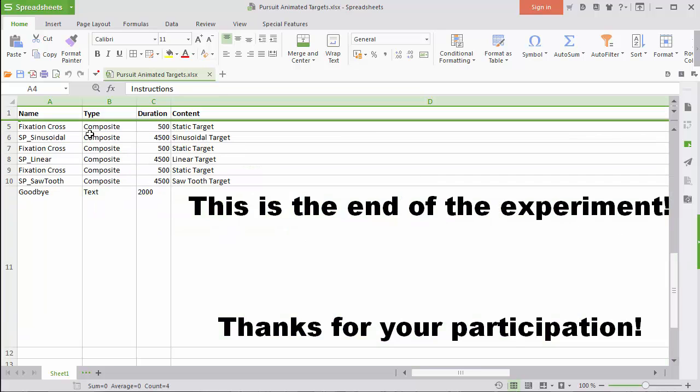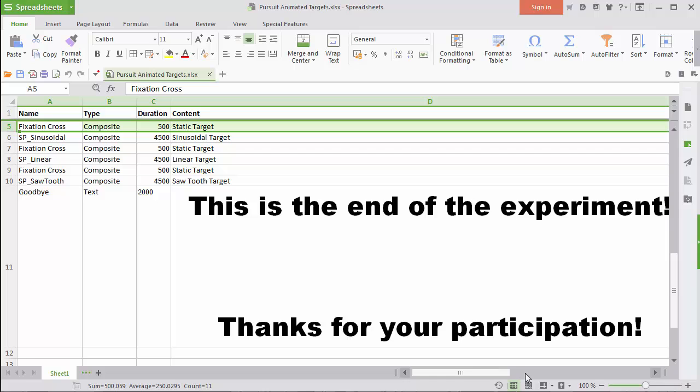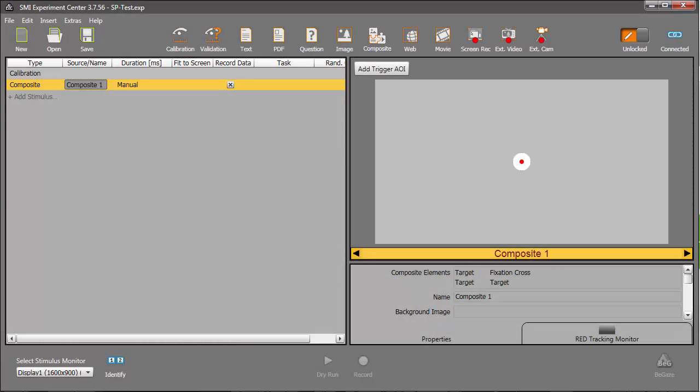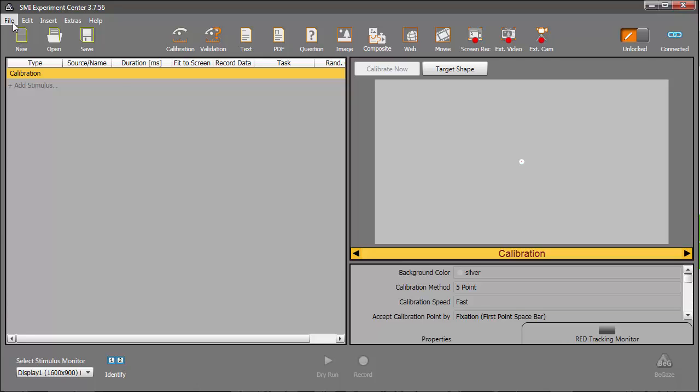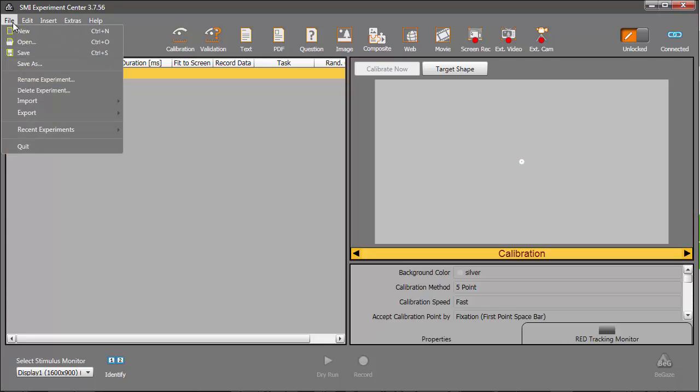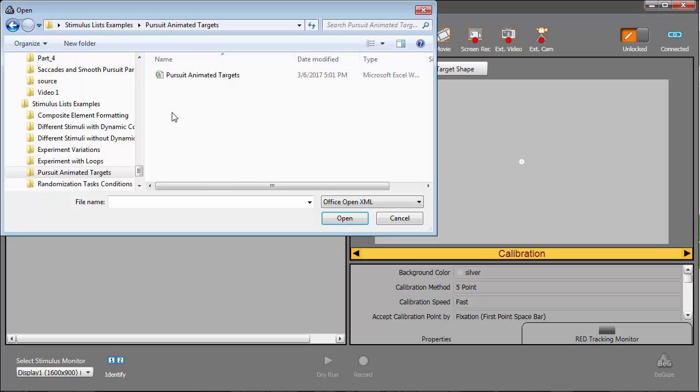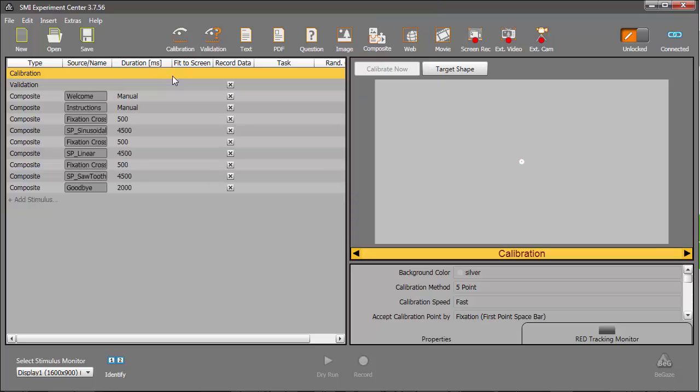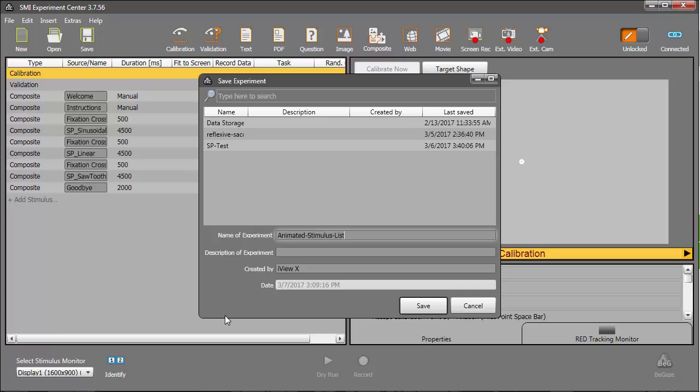Once you've built up your stimulus list in this format, bringing it into Experiment Center is very straightforward. Simply choose New, then File, Import, StimulusList. Navigate to the spreadsheet file and open it. And there's all your stimuli for the experiment.